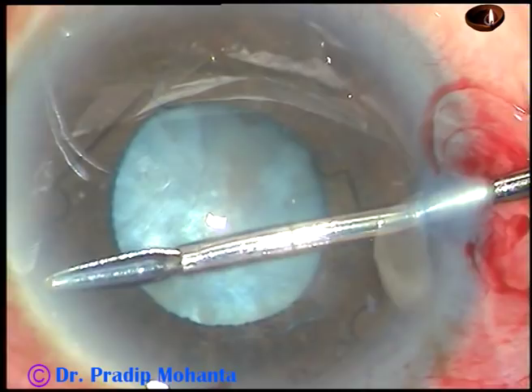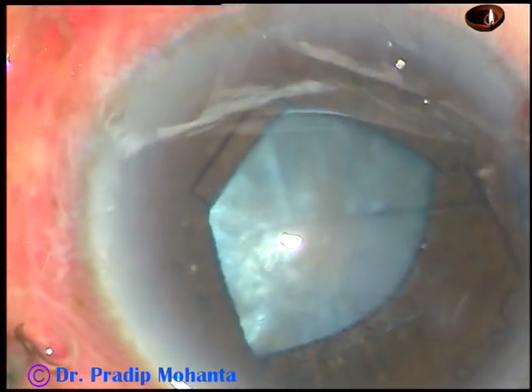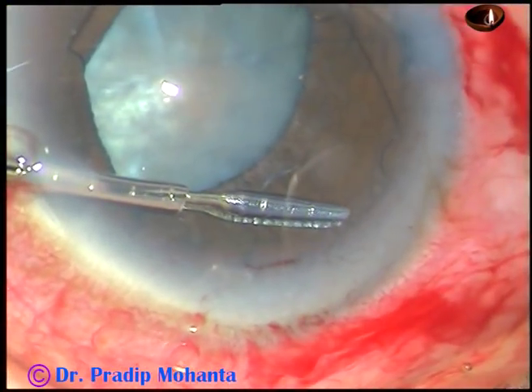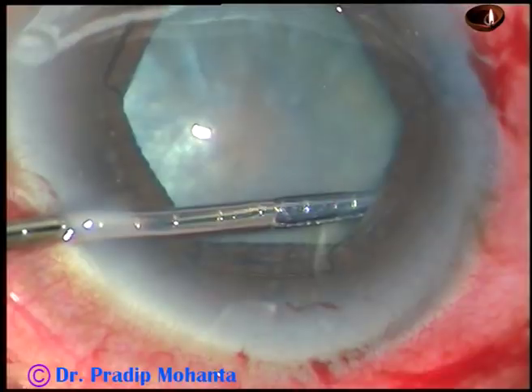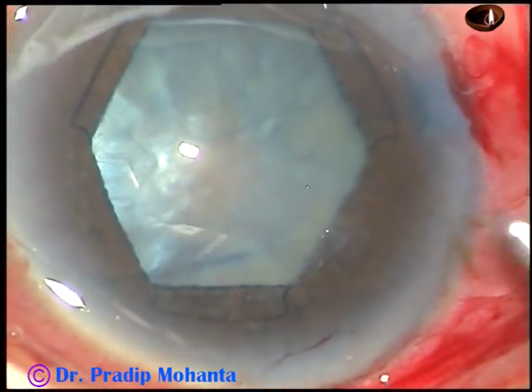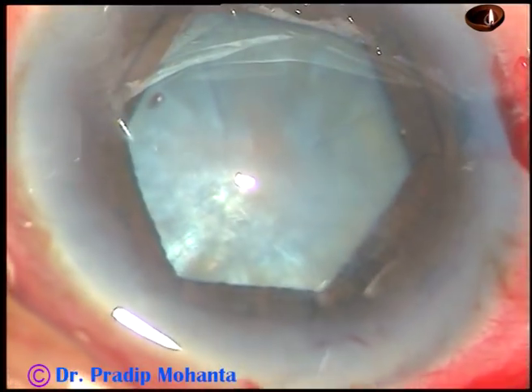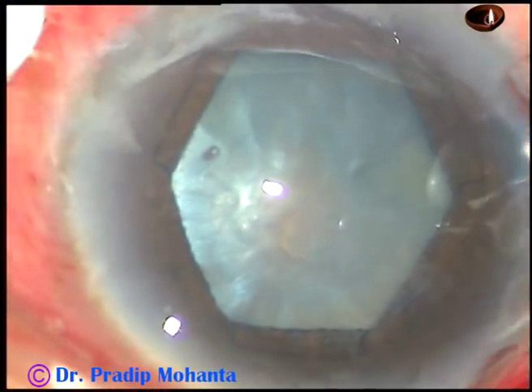This is the flange at around 1:30 o'clock or 2 o'clock, and it is tucked. Now I go through the left side port and tuck the flange which is at around 10 o'clock. So all the alternate flanges are tucked. After doing three or four cases, you will find it very easy to use this device. The pupil takes this beautiful hexagonal shape, and it's a very thin device — we can use it in very shallow anterior chambers.